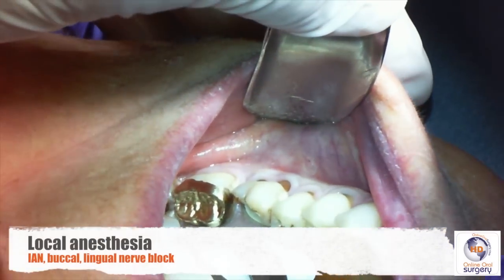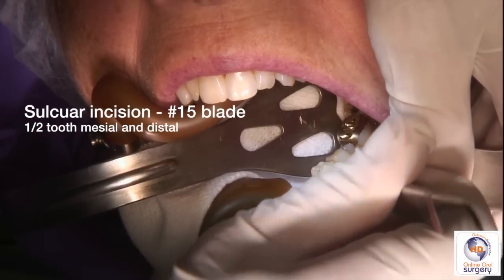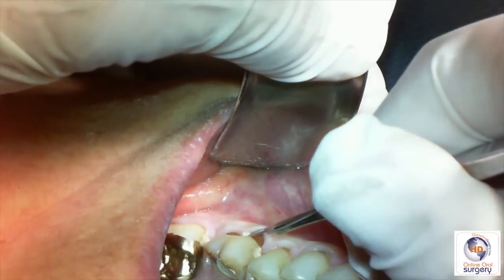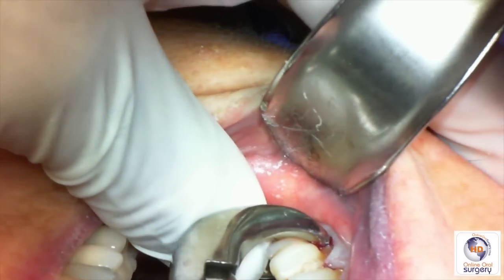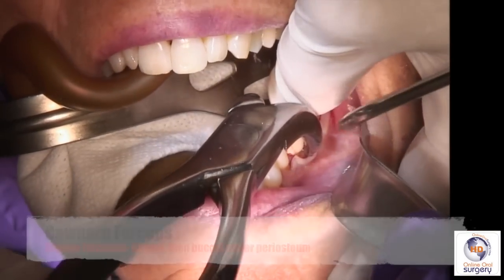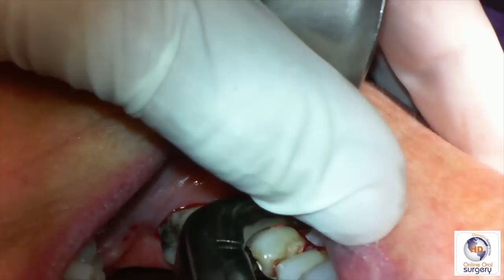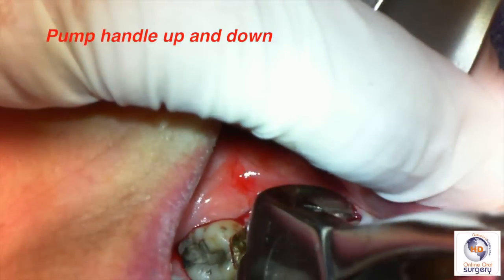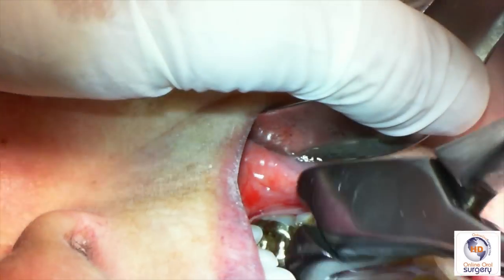After you've given an inferior alveolar, a buccal, and a lingual nerve block with whatever local anesthetic you want, we're going to go ahead and make a sulcular incision. We're going to start on the buccal and go about a half tooth on either side of tooth number 19 — on the mesial and the distal. We're going to place the beaks of the cowhorn forcep into the furcation, on the lingual side first, then subperiosteally on the buccal surface. We're going to pump the forcep up and down, driving the beaks deeper into the furcation — it acts as a class 1 lever to hopefully lift the tooth out of the socket.